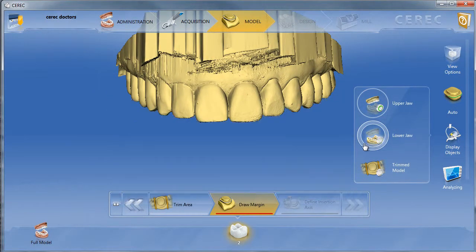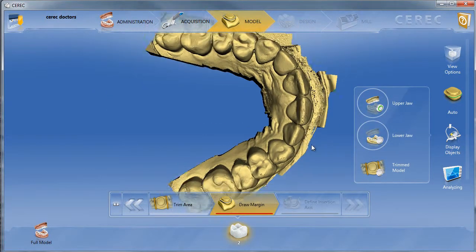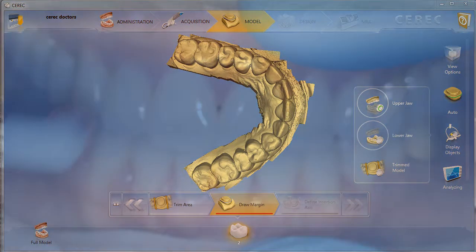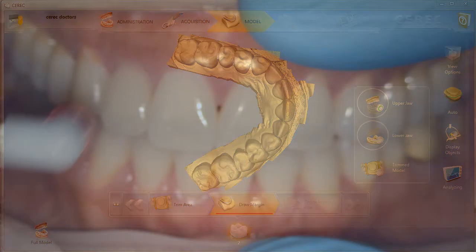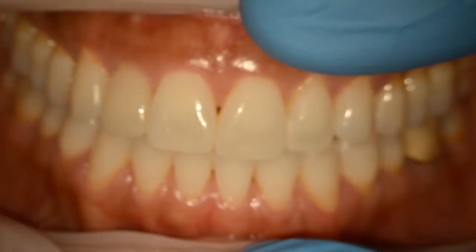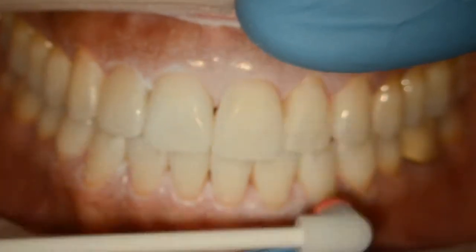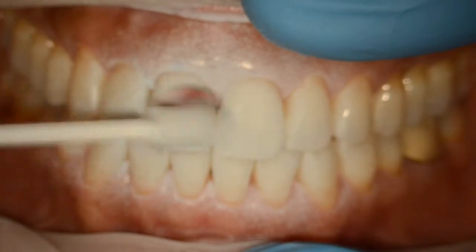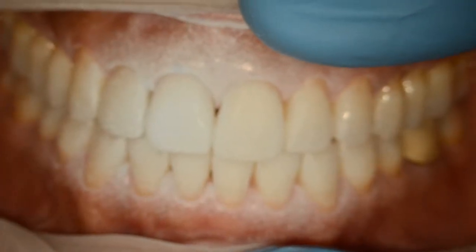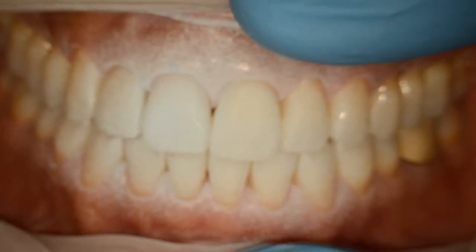This is Dr. Merzai from seriacdoctors.com and I'm going to highlight how to capture optical impressions so that you can develop a full arch upper and a full arch lower model. The very first thing we do is place the optic gate in the patient's mouth, have the patient bite down at maximum intercuspation, and we're going to go ahead and capture the buccal bite.